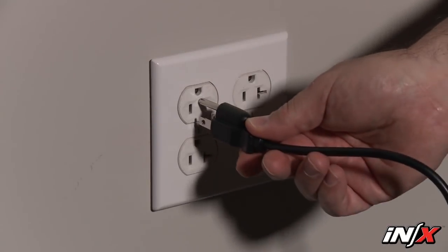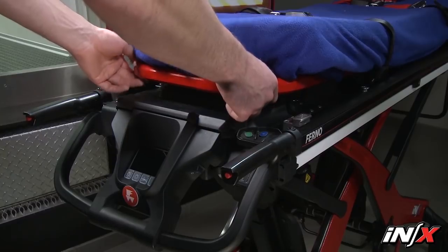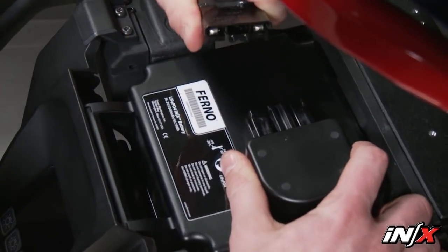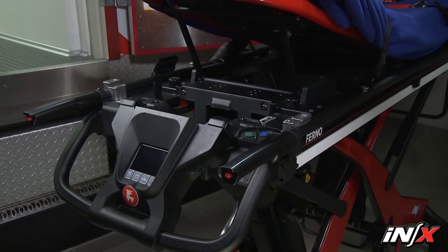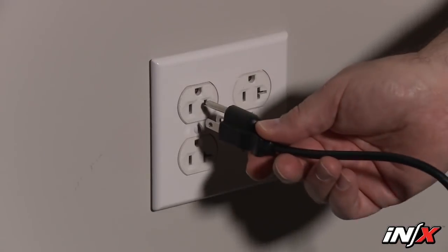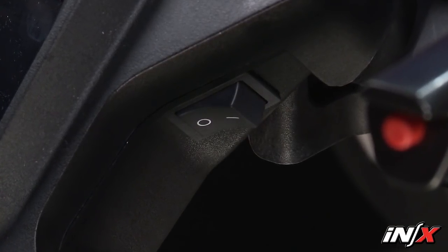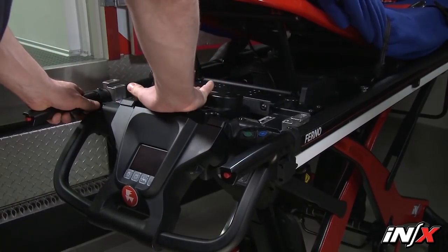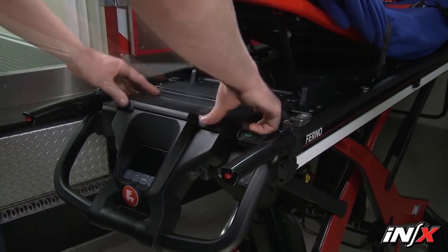To charge the battery through a household electric outlet, make sure the NX power switch is in the off position. Remove the battery from the NX by lifting the shock frame and removing the battery cover. Grasp the battery cable plug and disconnect the cable from the battery port. Use the battery carry handle to lift the battery up and away from the cradle and connect the battery adapter cable and battery charger to the NX battery. Then connect the battery charger to an electric outlet. To connect the battery to the NX, verify the power switch is in the off position and raise the shock frame. Angle and slide the battery into the cradle. Press down to secure the battery in place. Connect the battery cable plug to the battery port. Replace the battery cover and lower the shock frame.